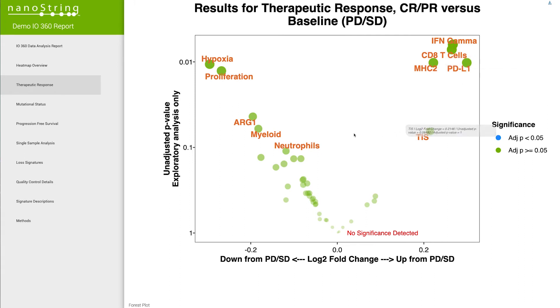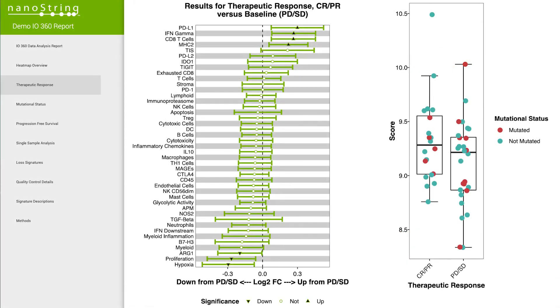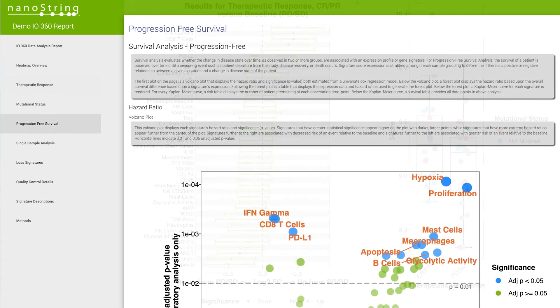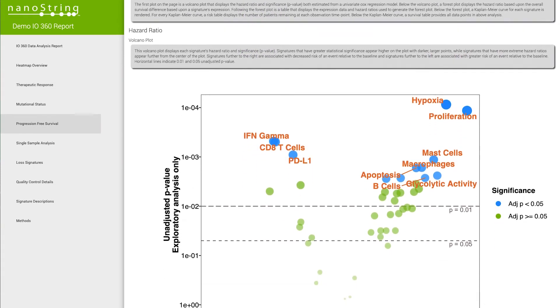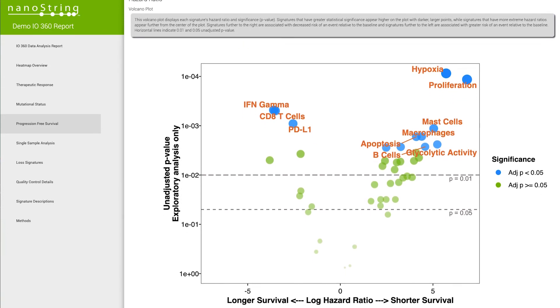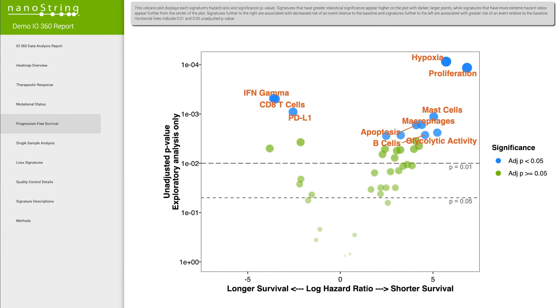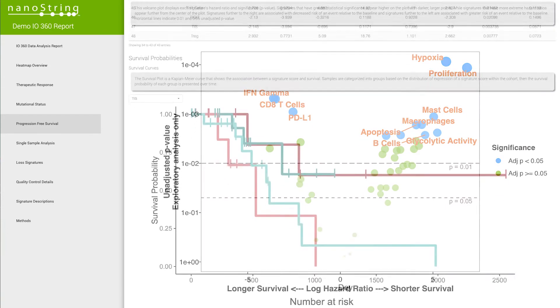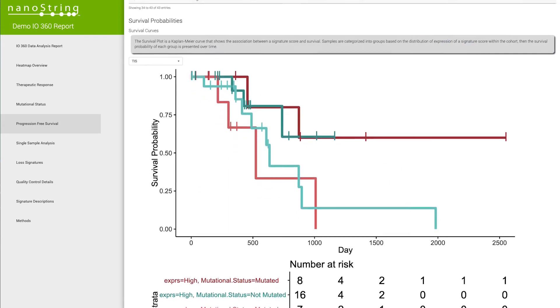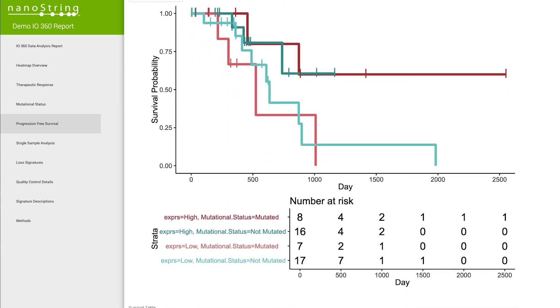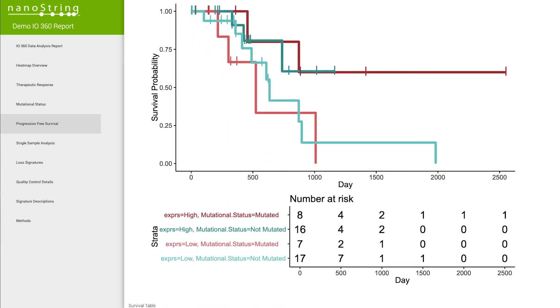Hovering over a single point in the plot displays more detailed information. Forest plots are also included throughout the report, showing the log2 fold differences between groups. For survival analysis, volcano plots depict signatures significantly associated with both shorter and longer survival, and Kaplan-Meier curves examine survival for each group and signature status.